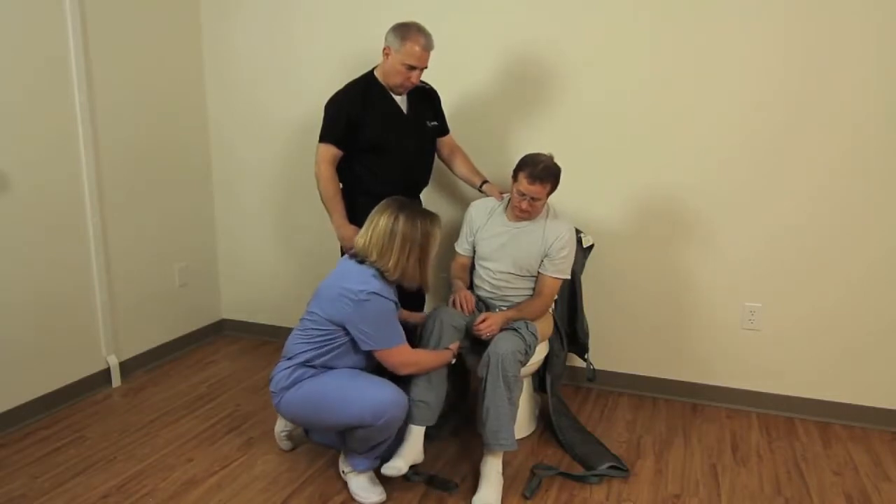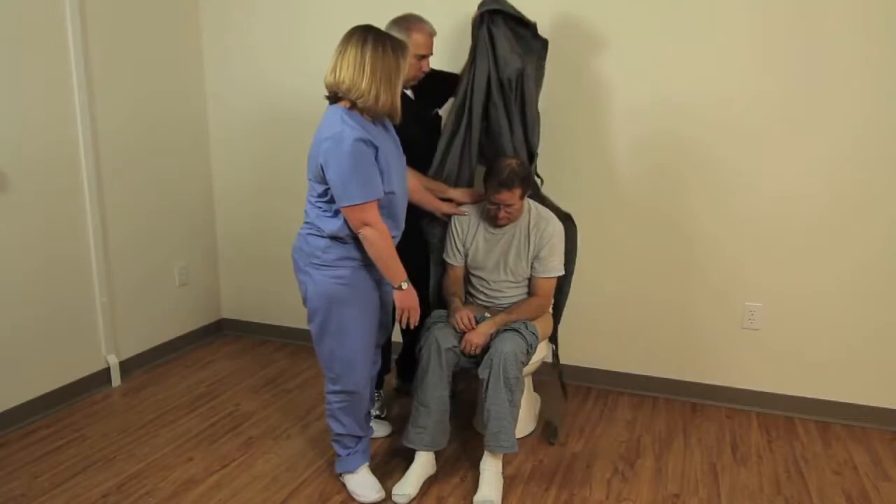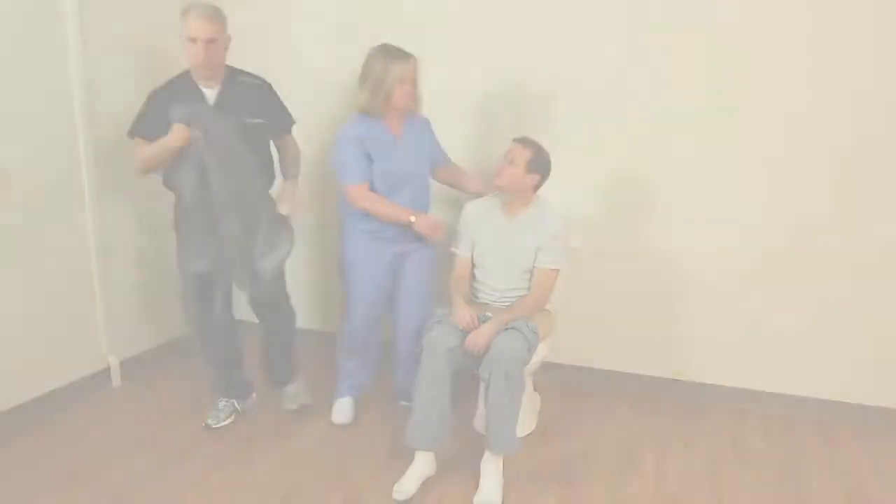Grab the loop strap and pull the leg strap out from under the patient to the side. Then do the same with the other leg. Now pull the pants and the undergarment all the way down.